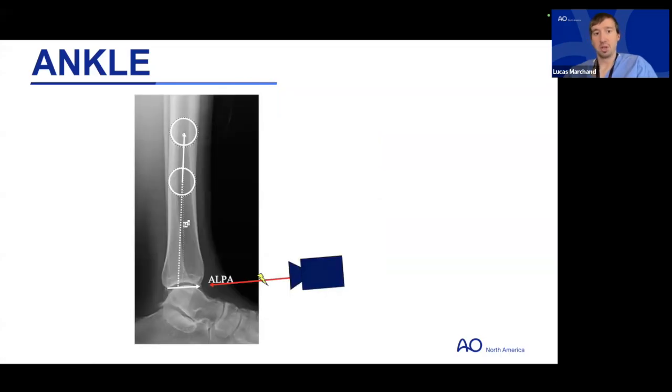And then finally, recognizing that the distal tibial plafond is not perfectly flat to the ground, much like the tibia. It has basically some slope built into it. And if you want to look perfectly down the ankle joint, or look perfectly down the distal tibial plafond, that requires some tilt of your x-ray beam towards the head or cranial relative to the imaged segment of bone.